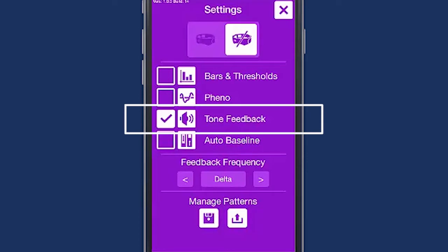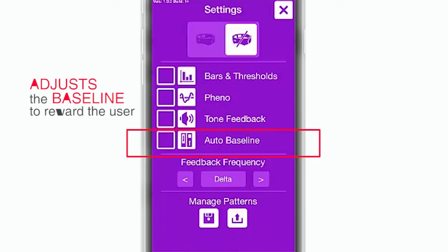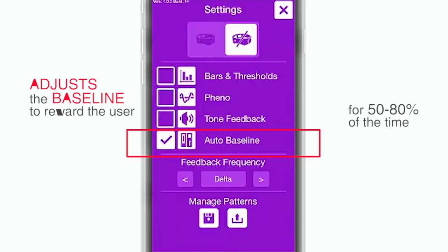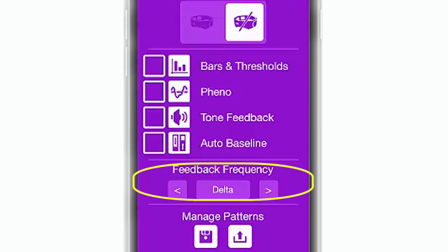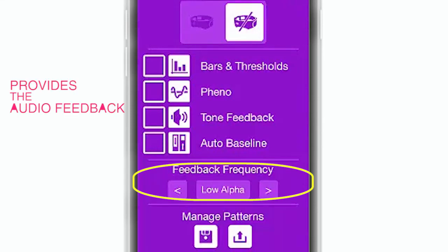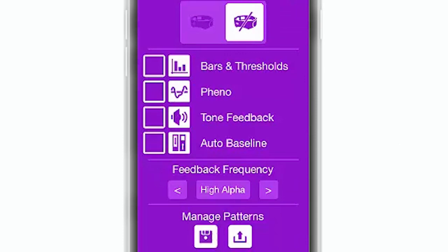Tone feedback lets the user hear their brainwave fluctuations in ascending and descending tones. The brain senses the changes and subconsciously modifies itself back to the original pattern. Auto baseline automatically adjusts the baseline to reward the user for 50 to 80 percent of the time during their training session. Feedback frequency selects the frequency band that provides the audio feedback for training with the tone.